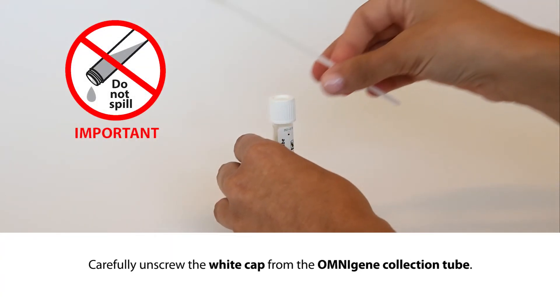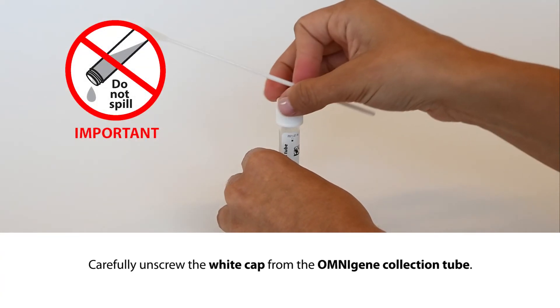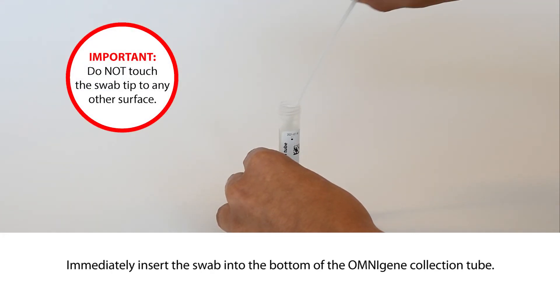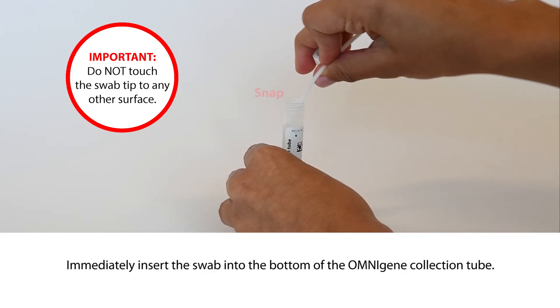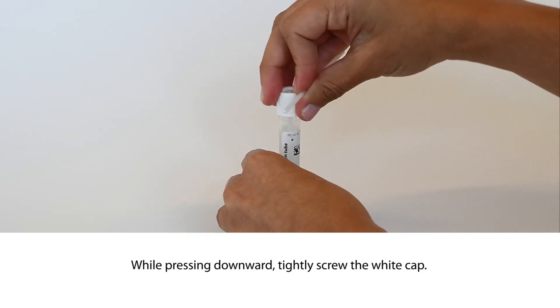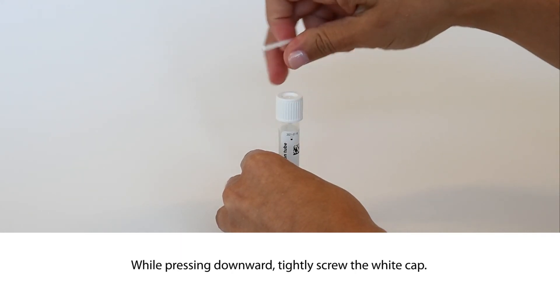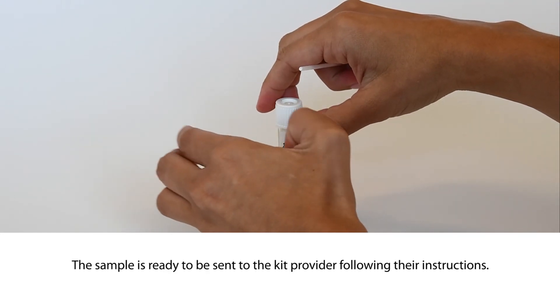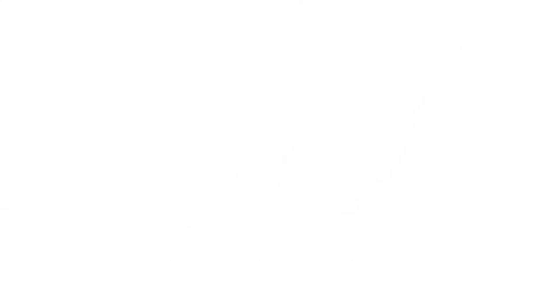While holding the swab handle in one hand, carefully unscrew the white cap from the OmniGene Collection tube. Immediately insert the swab into the bottom of the OmniGene Collection tube and snap the shaft off at the break point. Discard the handle. While pressing downward, tightly screw the white cap back onto the OmniGene Collection tube. The sample is ready to be sent to the kit provider following their instructions.